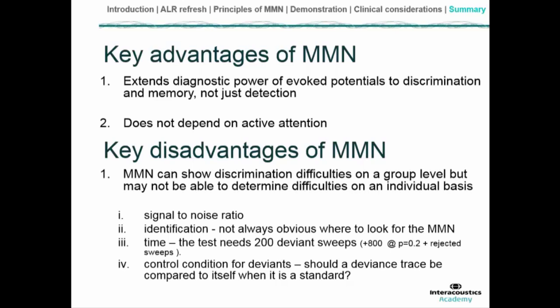One of the main difficulties or challenges is the adverse signal-to-noise ratio that results from the low probability of a deviant occurring, and yet the need to record many deviants to get an adequate response. But I should note some of the optimal stimulus recording recommendations that are provided by Duncan in that reference that I just provided, and might be a good way forward in progressing the field.